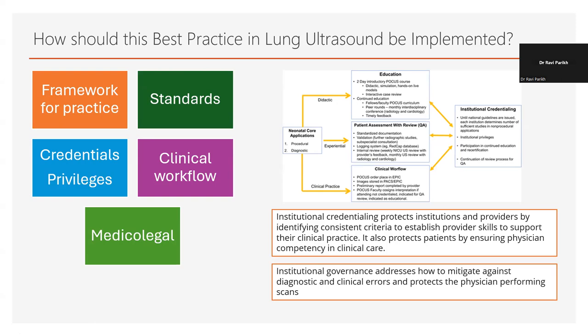So all of those things defined in this guideline, so that you really have the ability to document your reporting in a way that says that these are the diagnostic criteria that the guideline says we use for diagnosis when we're using an ultrasound. While we're learning, we're actually going to back this up by chest x-ray, because where time permits, if we can get a chest x-ray, that helps with diagnosis. It acts as a proxy, is the word I would use. But as we get more experienced, what we also understand is lung ultrasound may pick up a lot more than what a chest x-ray actually shows. So it keeps us safe from a number of ways.